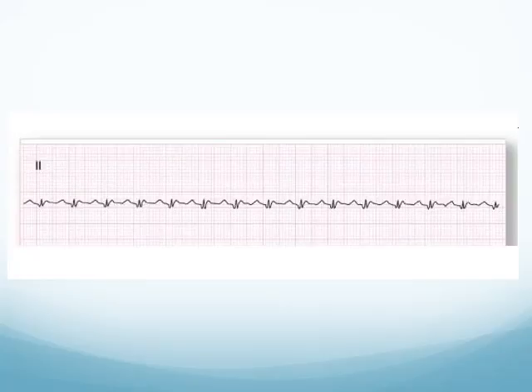Here we note that we have a rate of approximately 150. We have a regular rhythm.